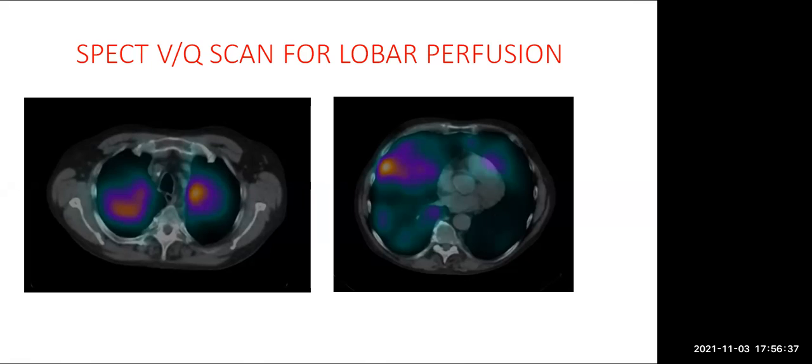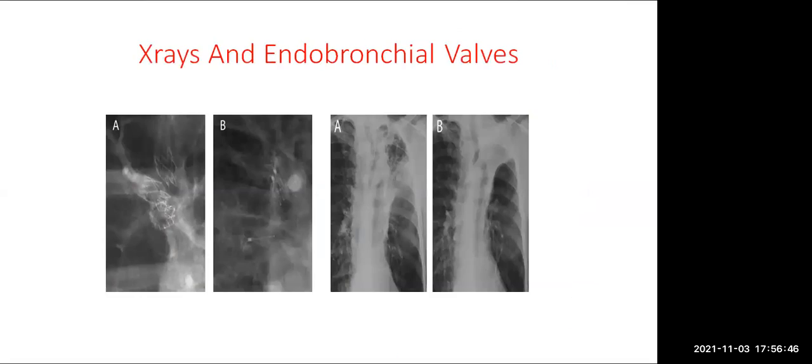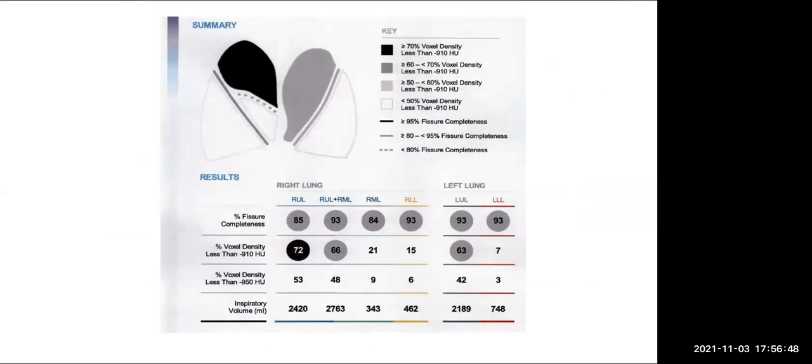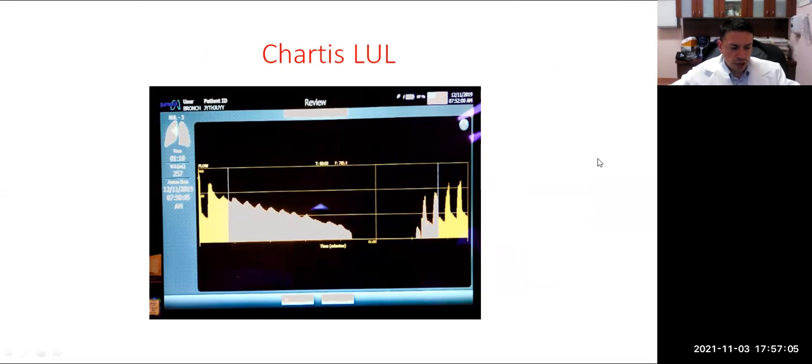Dr. Shostak, could you bring up the slide that showed the flow dropping down and then the resistance going up for the Chartis? Right. Do you see a lot of variety in the amount of time? In other words, can there be a very slow, long downflow if the collateral is minimal in amount? Oh yeah, absolutely. It's a good question.